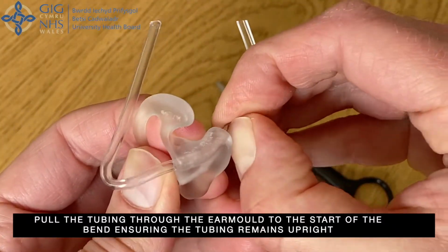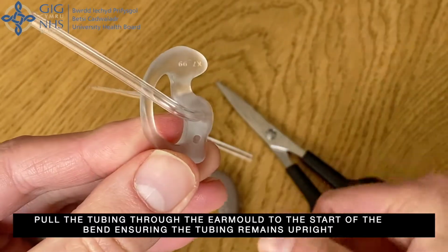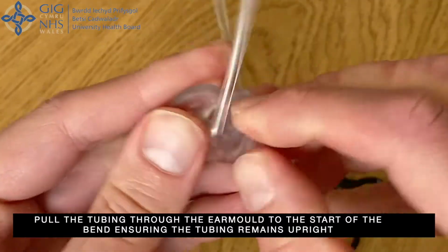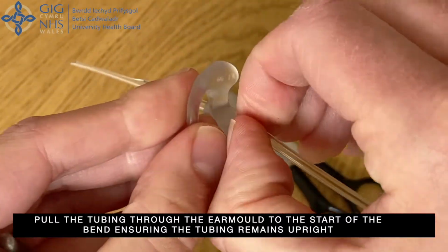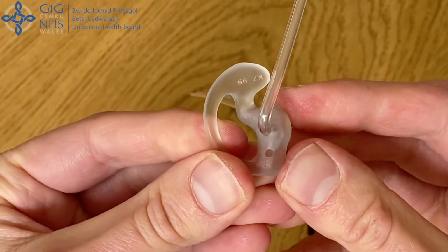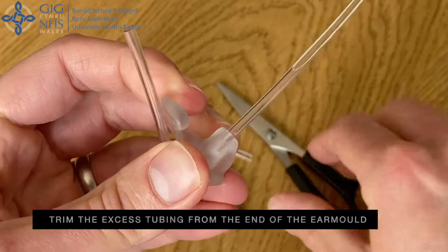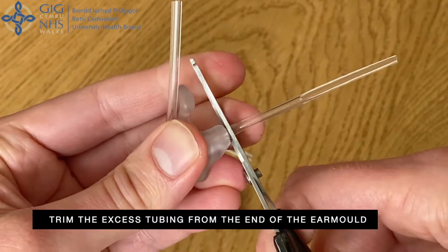Pull the tubing through the ear mould till it reaches the start of the bend, ensuring that the tubing remains upright. Trim the excess tubing from the end of the ear mould.